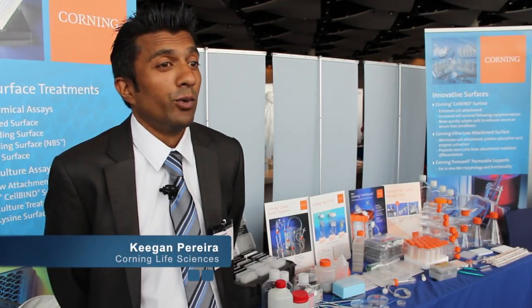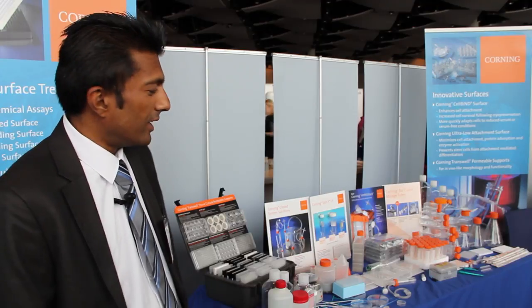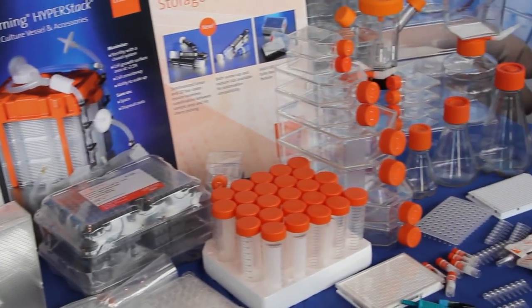Hi, my name is Keegan Pereira, I'm from Corning Life Sciences. We do a lot of tissue culture products, a lot of PCR products, and all this is on display as you can see. We have a hyperflask there and a new hyperstack for large volumes of cell culture.